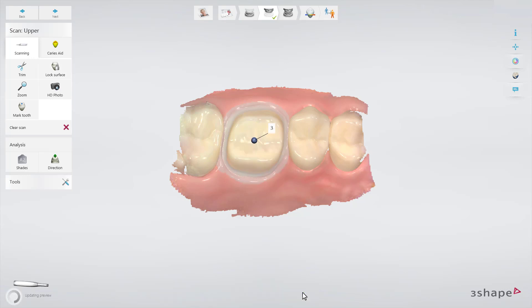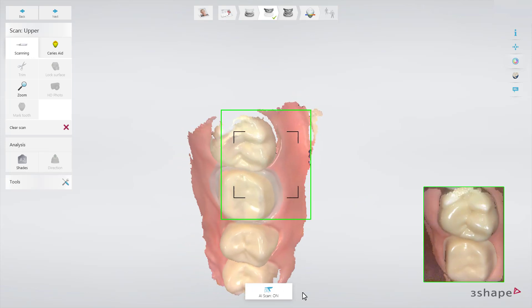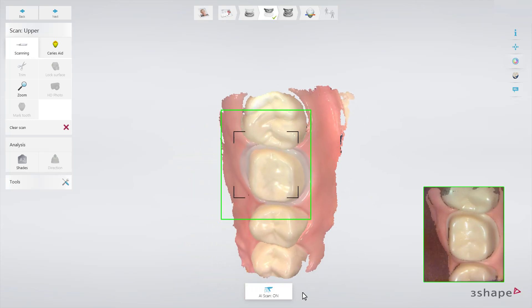Now start scanning the rest of the jaw. The locked area will not be updated by further scanning.